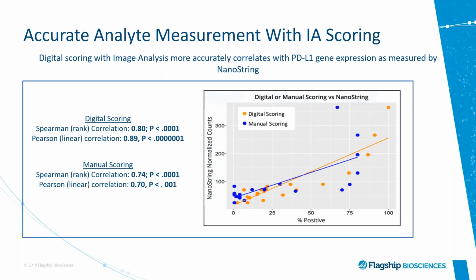Now, there is another point that I'd like to make. As I said, this is related to the accuracy. So traditionally, you know, the accuracy of this digital method is evaluated in relation to the manual scoring of the pathologist, and that's still kind of the standard approach.